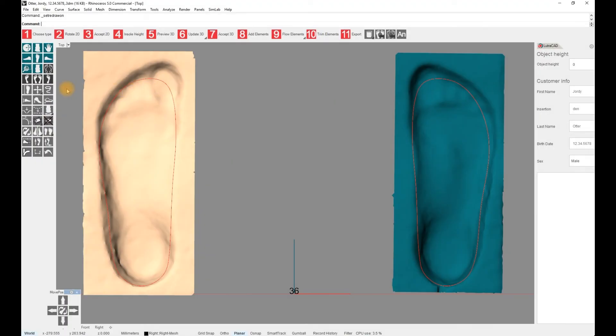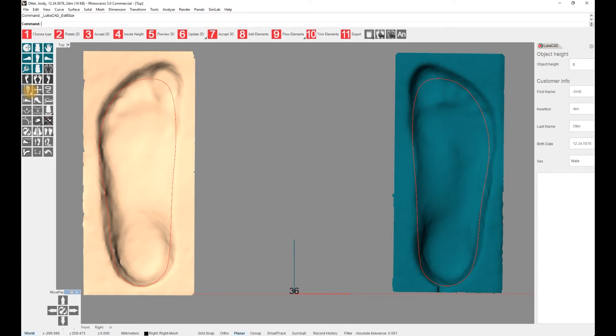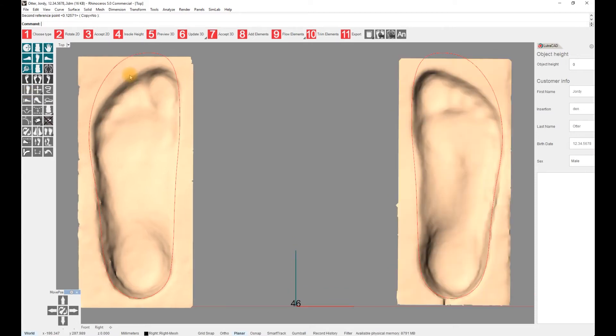The shoe size can easily be adjusted with a button on the left toolbar. You will be asked for the new size and the software will automatically resize the pattern.